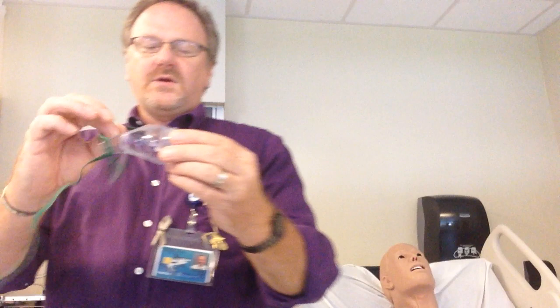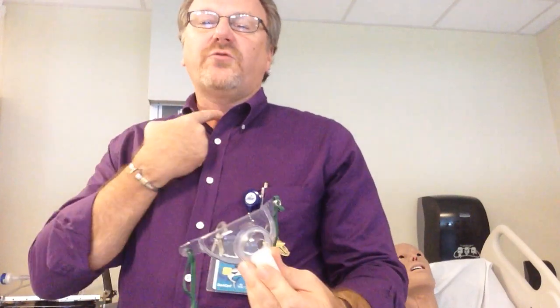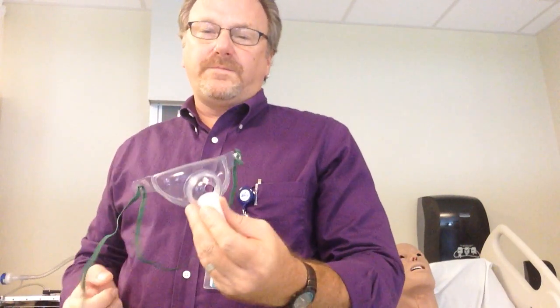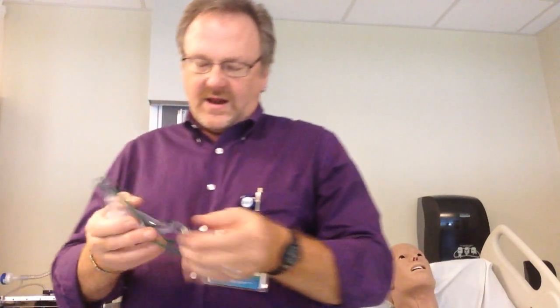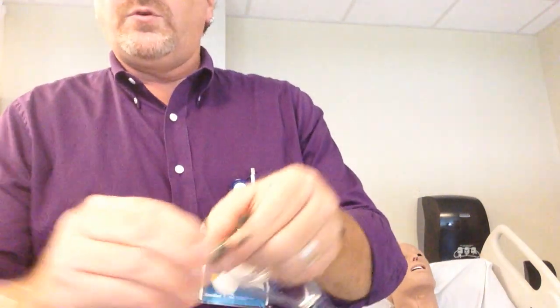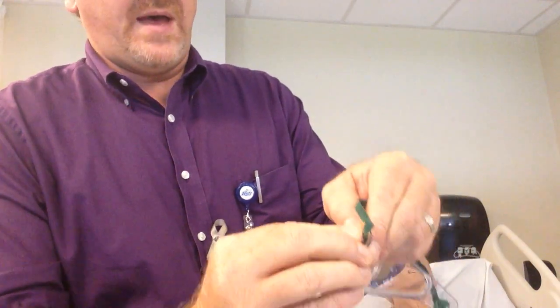The trach collar goes exactly where you think it would. The tracheostomy is an airway in the neck, so we would put it on the patient there. You can unsnap it — you do not have to go around the head. You feed the strap behind the neck and then re-snap it.